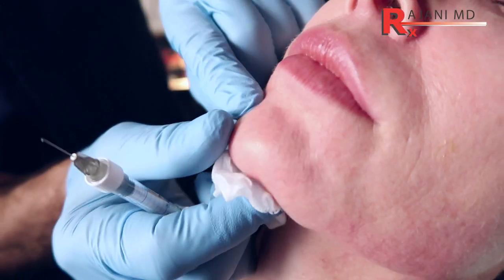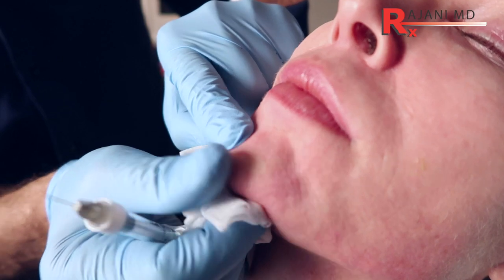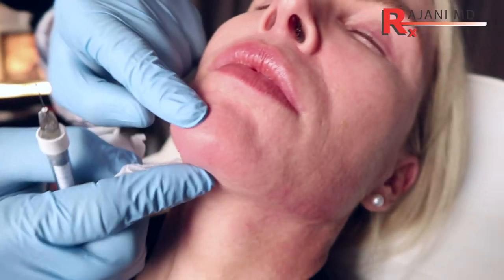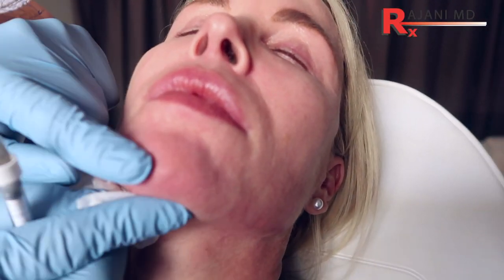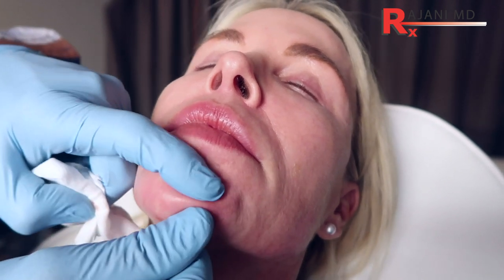You mold a little bit. And of course, we would use some Dysport or Botox in the mentalis itself. Everyone gets DAO toxin, and that helps the area look good. But in this case, we will do some Restylane skin boosters to rejuvenate the skin.